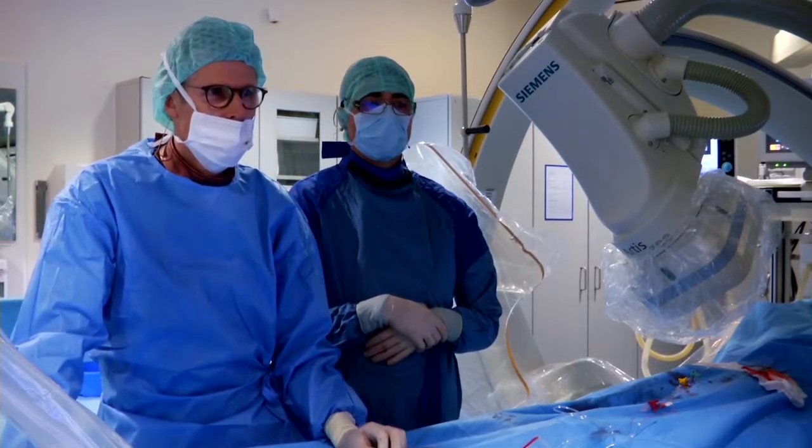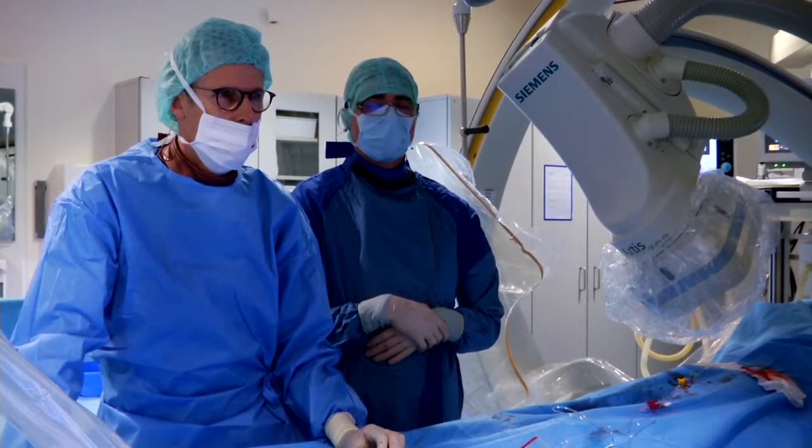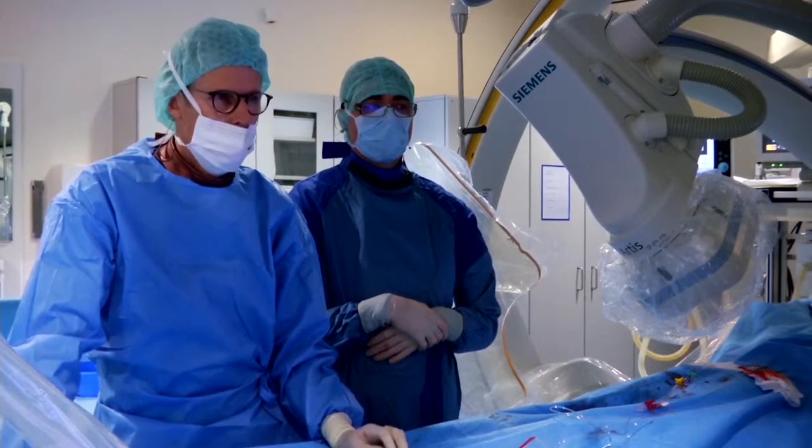Peter, for one, Axel here from Berlin. Do you have any idea why in this child we have so much intima proliferation, and how will you deal with that in the future?